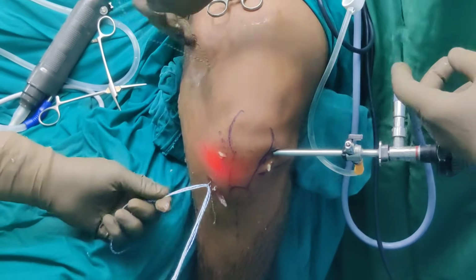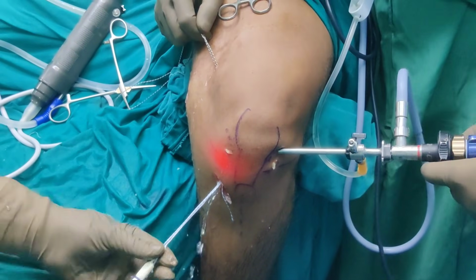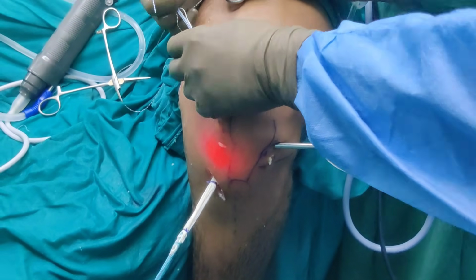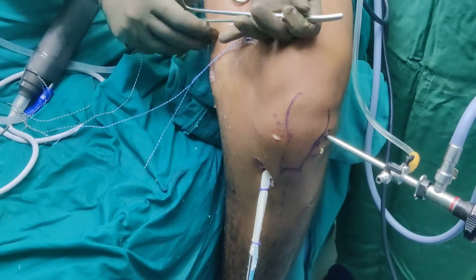Abhishek, can you pull it up? Yeah, just be very kind. Abhishek can be very, very aggressive. So just keep pulling. Come on Abhishek, well done, well done. So all these sutures have come back on the top. That's it. So we are pulling the graft slowly first into the tibial side.